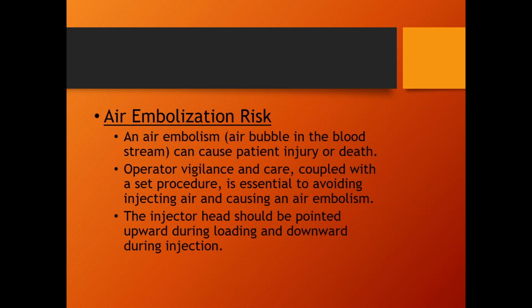Yeah, same thing though. They don't want to stop the injection in the middle of the injection. So they're just very adamant about not using it. Like I said, every model has them. I've never in my life actually seen one in use on a machine when I was in the hospital. Not one time. So it's obviously not something that comes up much.